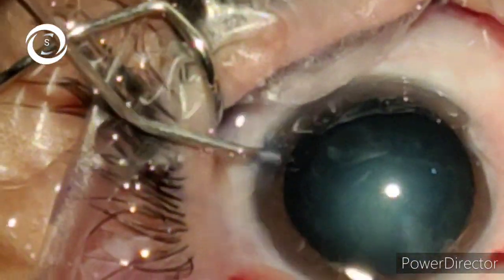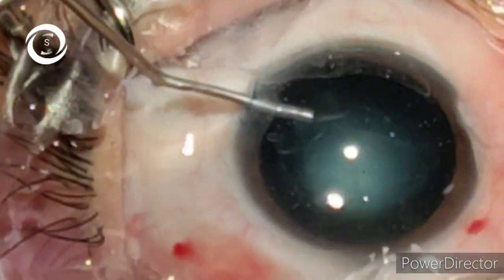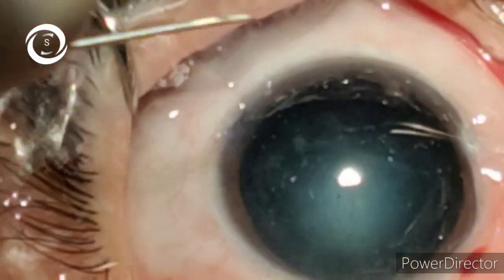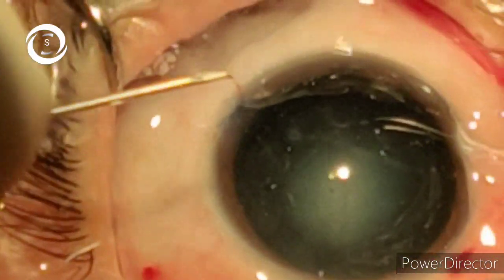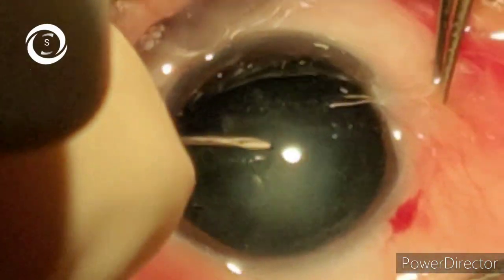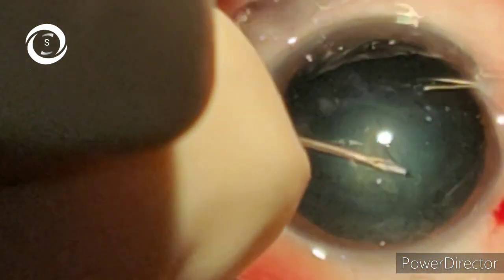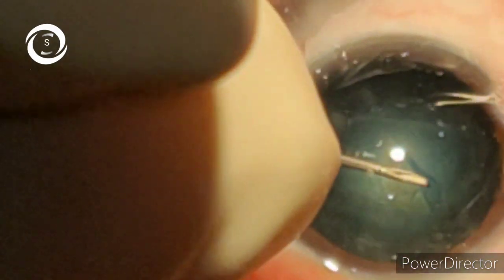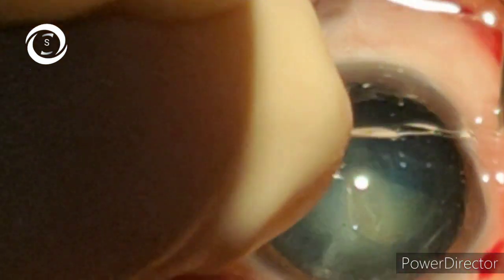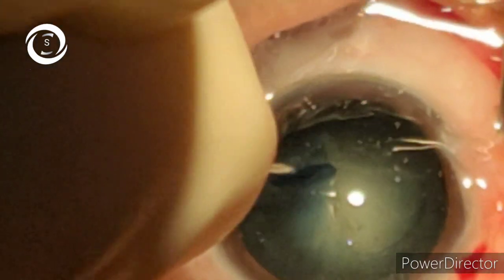The first is capsulorhexis. Your continuous curvilinear capsulorhexis should be round, it should be regular, it should not be very small and it should not be very large. Here you can see after deepening the anterior chamber with viscoelastic, I am performing the capsulorhexis with the help of a cystitome — you can also use utrata.